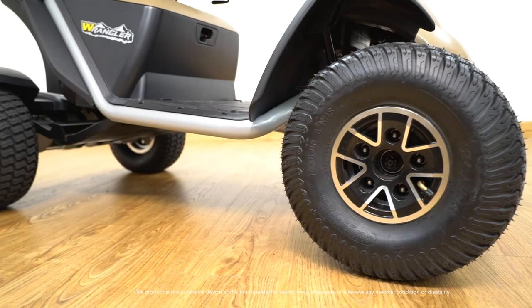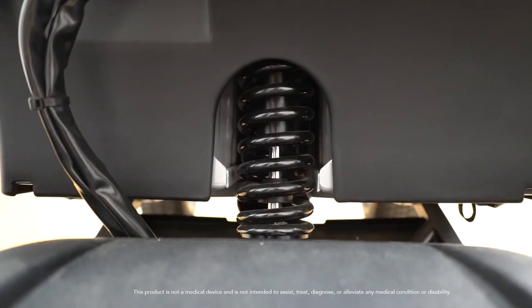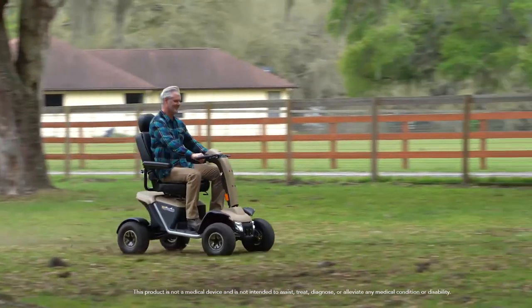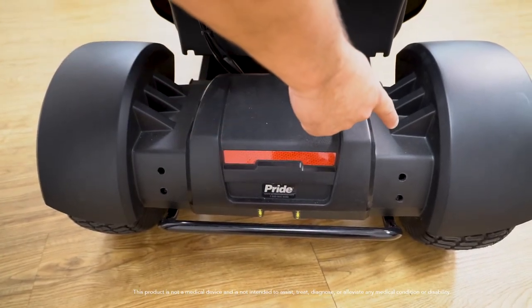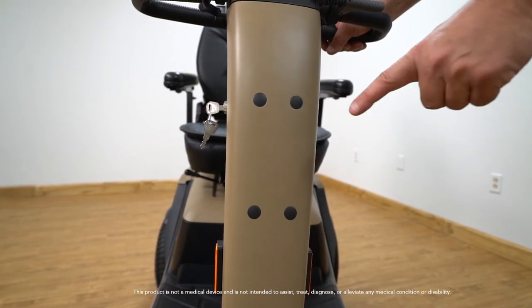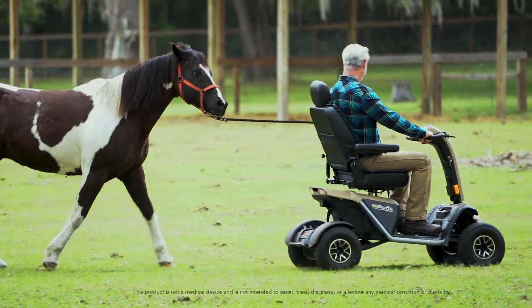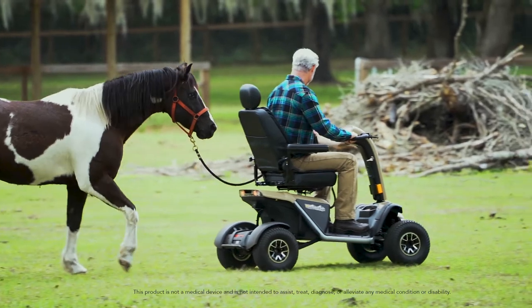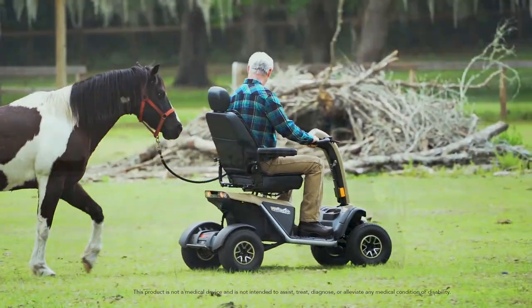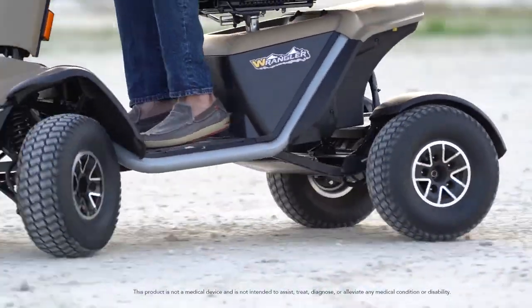The Wrangler has 14.5 inch tubeless pneumatic tires on the front and back to go through almost any terrain. The CTS front and rear allows for a more comfortable ride when off-road. Dual motors provide exceptional traction if one wheel should happen to raise off the ground. A front basket can be added as an accessory to the tiller by simply removing the plastic covers. Rugged and built to last, the Wrangler is everything you want in an outdoor scooter. Equipped with front and rear suspension, this aggressive scooter is designed for cruising on walking trails or driving around your property. The Wrangler is the perfect way to embrace life in the great outdoors.